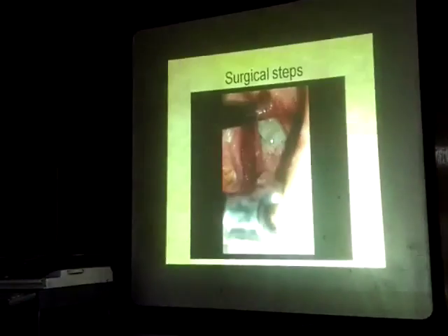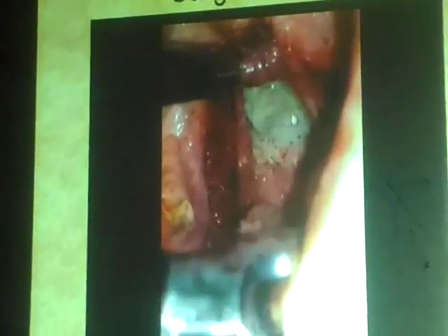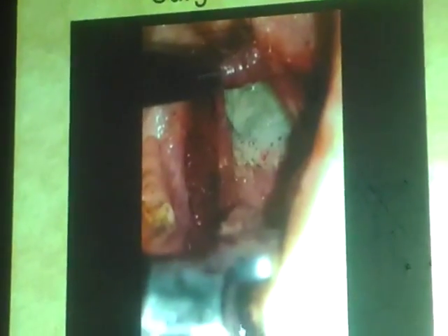And number three, and this is what I think is important, is that when you use the hydrogen peroxide cottonoid, it's going to soak the area with this white color, so that when you remove your cotton, if there is any still bleeding spot, you will detect it, you will see it very quickly, and you will see this in a minute.